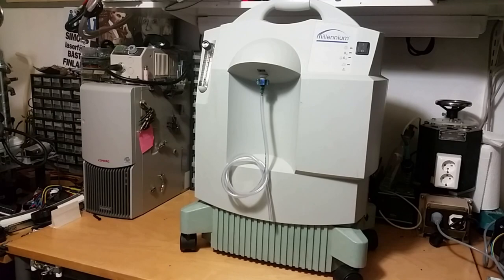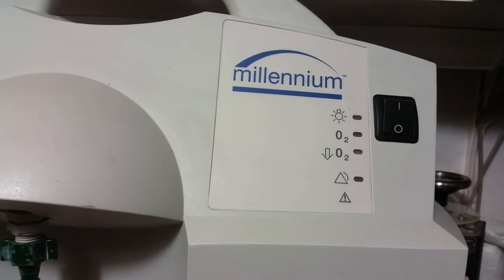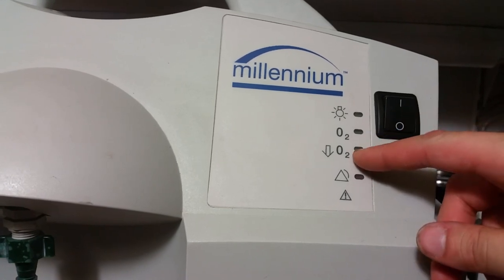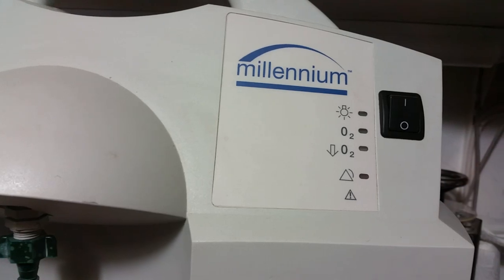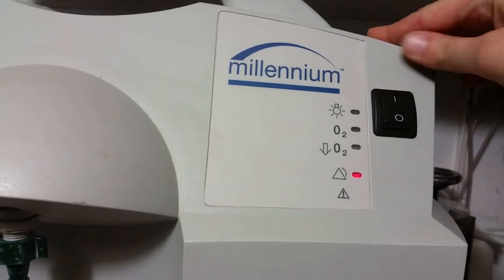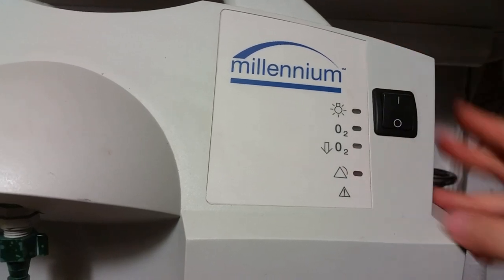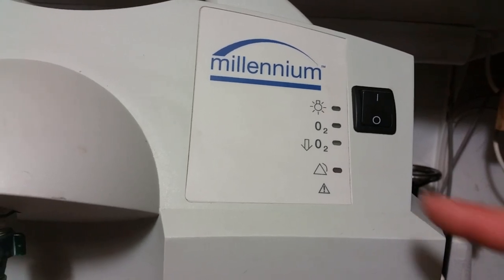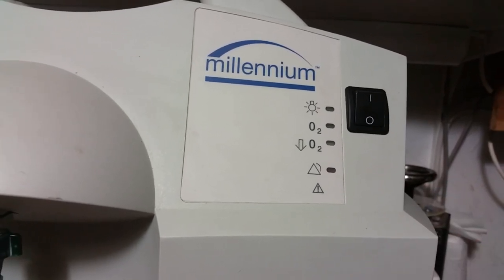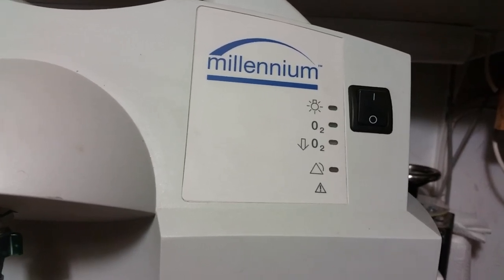It's a pretty big and heavy unit. On the panel you can see it's a Millennium — we've got power, oxygen, and low oxygen indicators, and some warnings. If I turn it on right now it just alarms because I haven't plugged it in yet. It has a 9V battery inside. If a power cut occurs, this will sound an alarm so the patient knows to switch to an oxygen bottle instead.